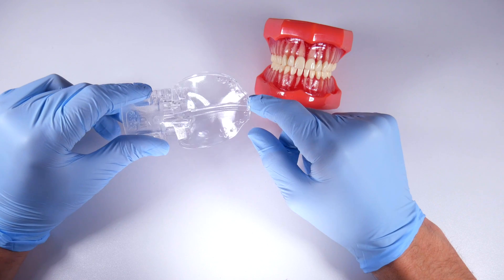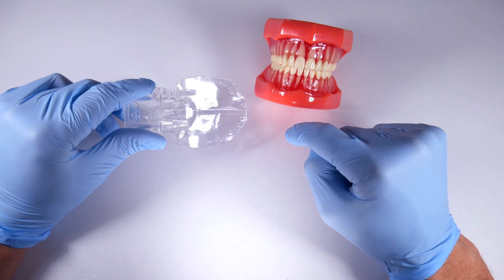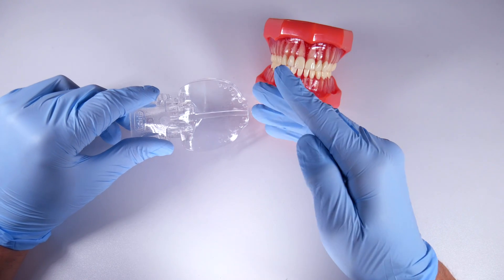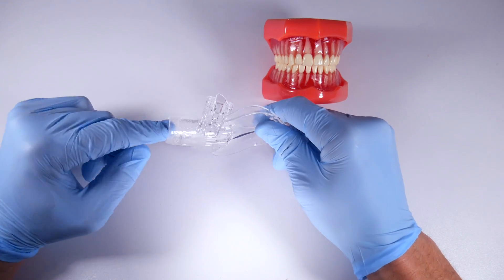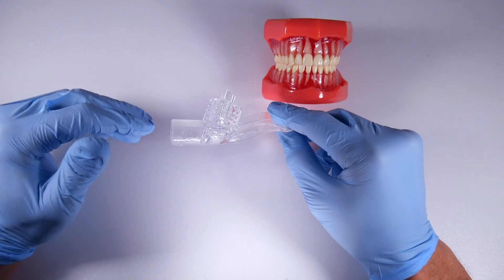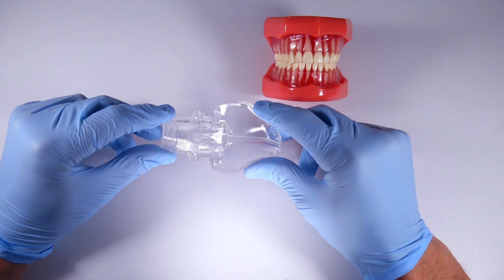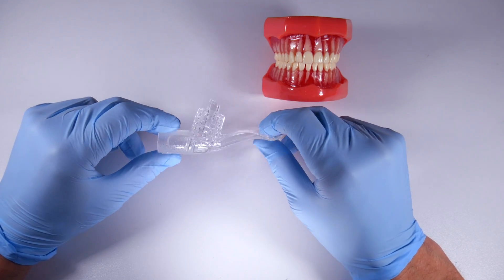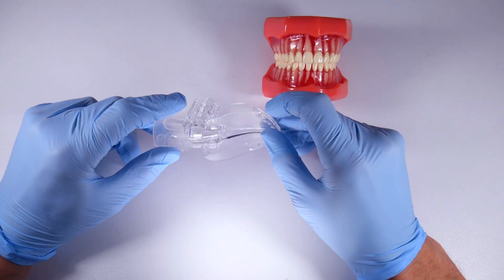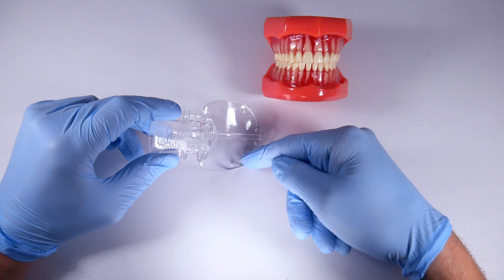This is actually modified — normally there's a buccal segment that kind of swoops out and comes around here, retracting the patient's cheek. It's hooked up to high volume suction. It's a proprietary system so you have to buy the hookups for your high volume. I use this for everything — operative, crown and bridge — not endo obviously because we use dams for that.